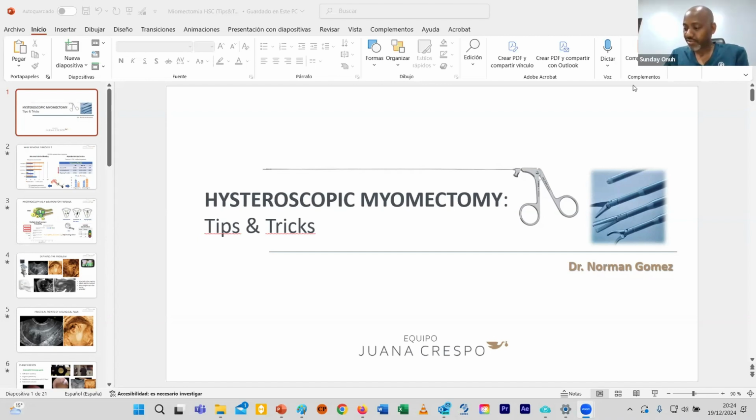There are 2 more questions, and we'll wrap it up. With free floating myomas, because from when you did the multiple myomas, a lot of them were freely floating, does that not pose a challenge for you to resect, I mean, using the tissue retriever? Why didn't you leave the stock on the base before introducing the tissue retriever rather than removing all the fibroid?